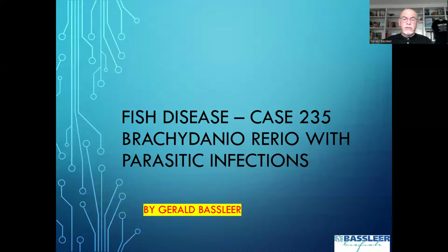Hello, dear aquarist. Today you will see a case on a zebra danio, Brachydanio rerio, with a parasitic infection. I will show you my PowerPoint and the fish in the aquarium and their parasites, which I examined with the microscope. It's my case 235.